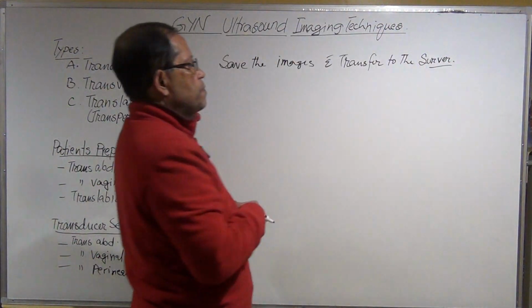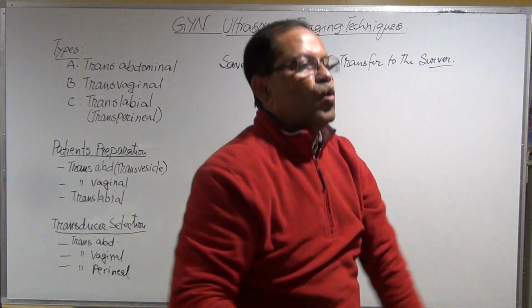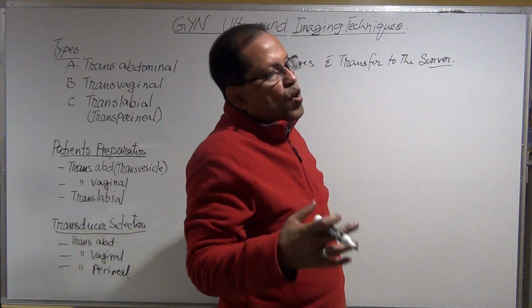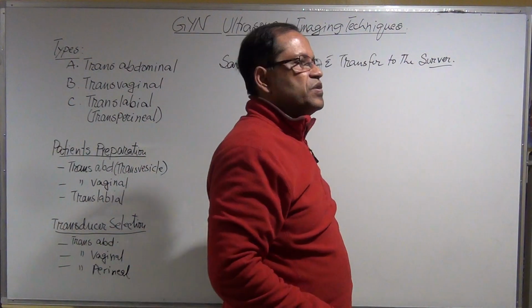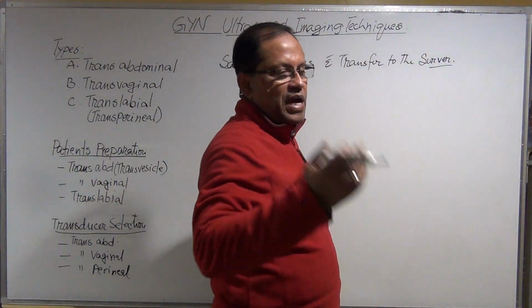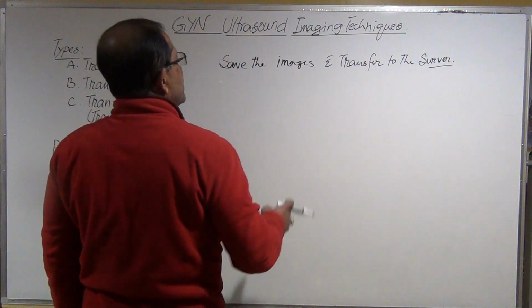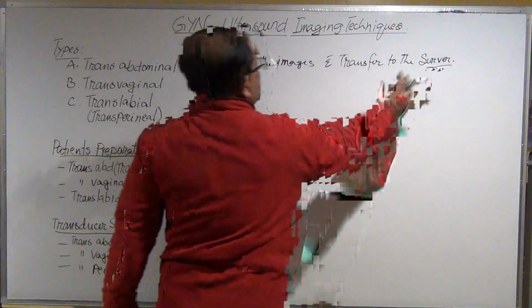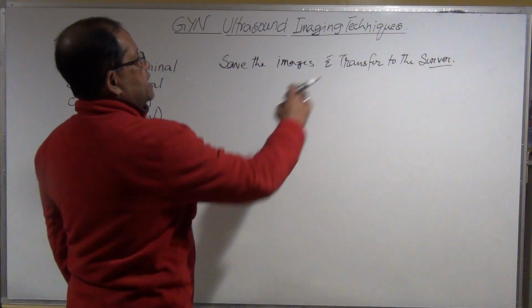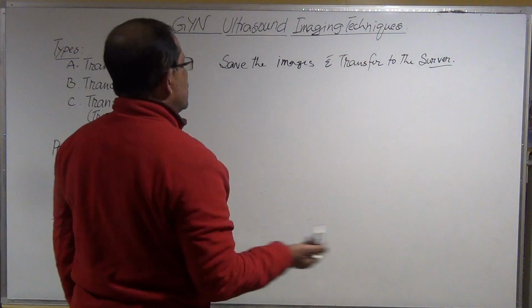All the images are stored in that server, and whoever wants to retrieve the images can retrieve them by the MR number or by the name. When it is in the server, it can go easily to the radiologist, but you have to do a little more.